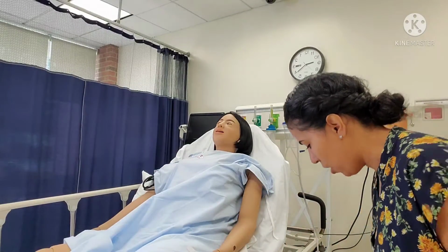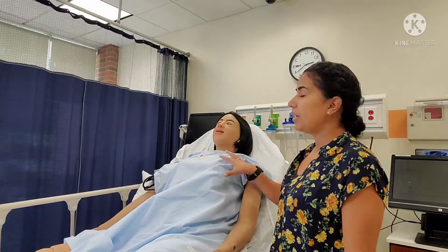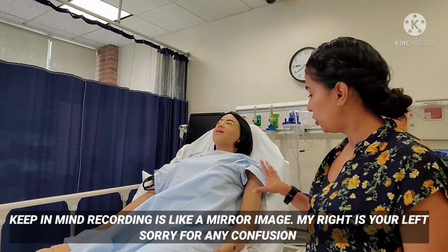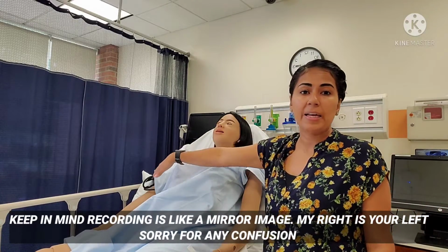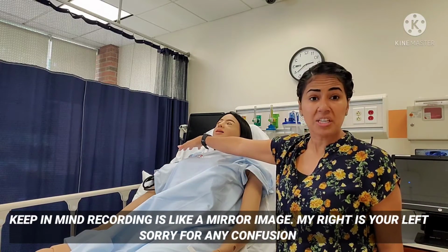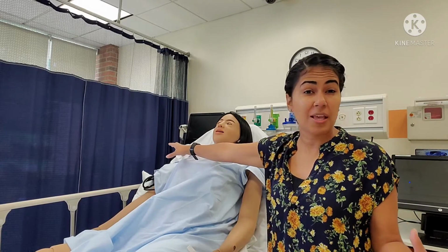Now, because I saw that, am I going to go look at this guy's toe? No, I'm going to grab my stethoscope, right? I'm going to listen to his lungs or her lungs. Today it's a female, so I'm going to listen to her lungs. And when I listen to her lungs, what are they going to sound like? Well, the chest tube is on the right side, so if I listen to the left side, how is it going to sound? Should sound pretty good, right? Unless there's something else going on. Lungs on the left side should sound really good.